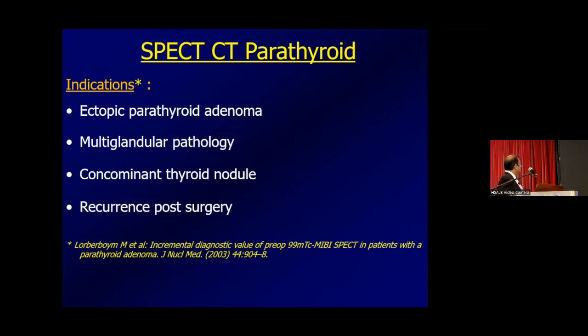Whenever you suspect there will be an ectopic parathyroid adenoma, whenever you are suspecting multiglandular pathology like in tertiary hyperparathyroidism, whenever you suspect there is an associated thyroid nodule, or if the patient is presenting post-operatively with recurrence, the SPECT-CT is imperative and it becomes part of our day-to-day practice of sestamibi planar parathyroid imaging. So along with the planar, you must do a SPECT-CT in all these clinical indications.